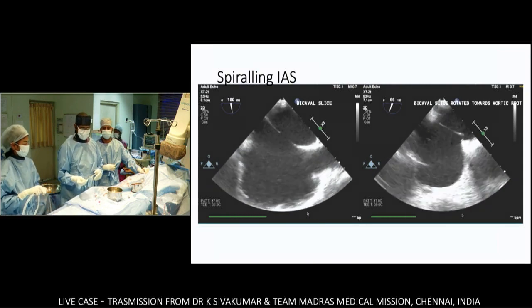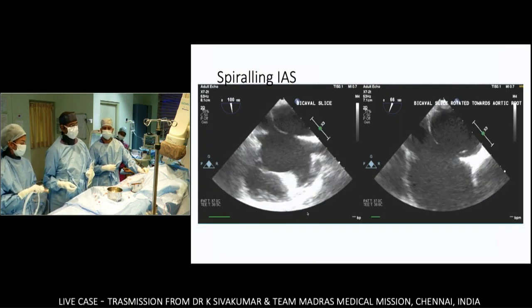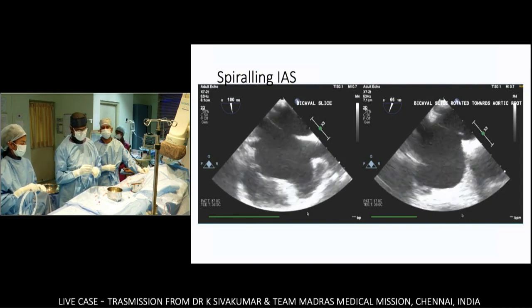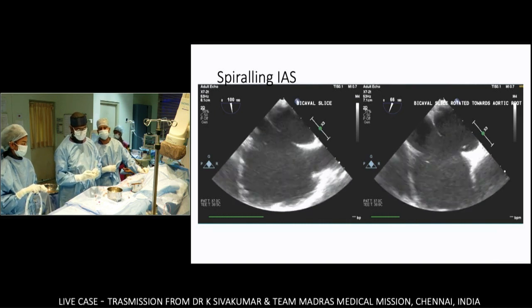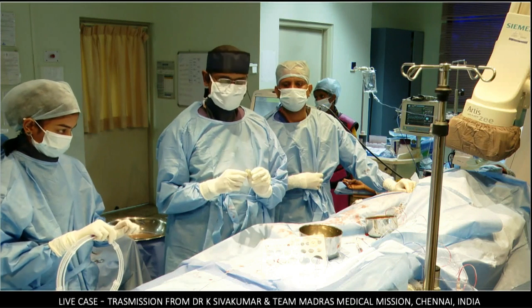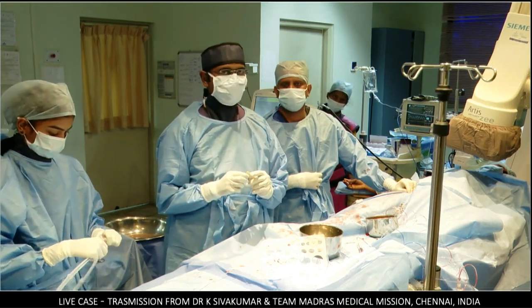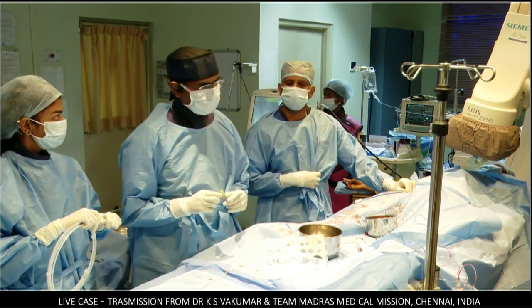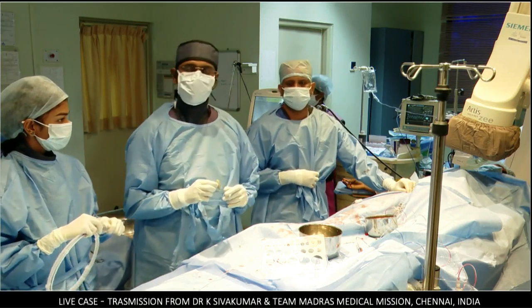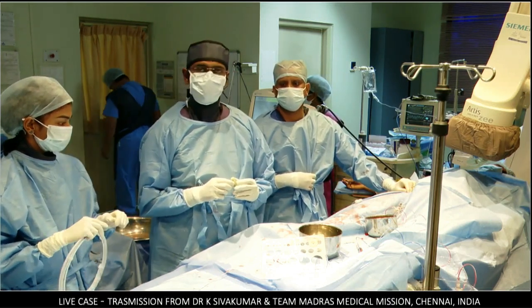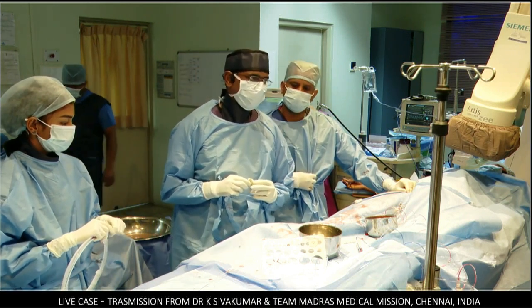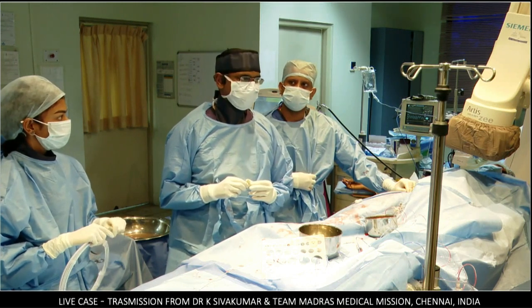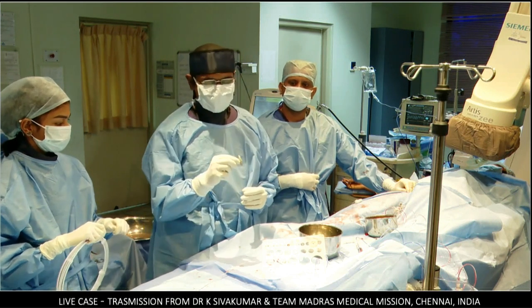The device we are going to show today is the HeartEx device. This is the first time I'm using it. It was conceptualized by Dr. Joseph Thathachan. We just got regulatory approval — it's a very new device. It has not been used anywhere in India. I heard that Dr. Tin from Vietnam had used it on about four or five patients.